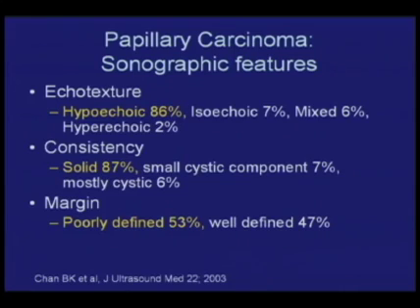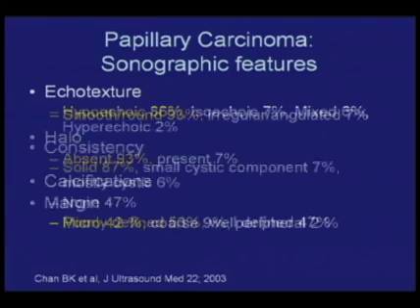When we look at the features of papillary carcinoma, there are a variety of things we may see, but as nicely summed by this paper by Chan et al. in the Journal of Ultrasound in Medicine 2003, there are some patterns which are the most common. In terms of echotexture, hypoechoic echogenicity is the most common. In terms of consistency, solid consistency is the most common. And in terms of margins, there's a slight edge towards a poorly defined margin. However, we can see that papillary carcinomas, in fact, may have almost every possible characteristic sonographic feature.